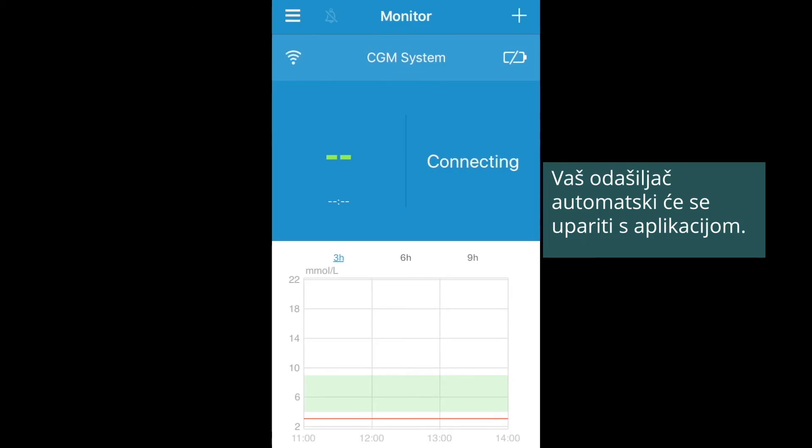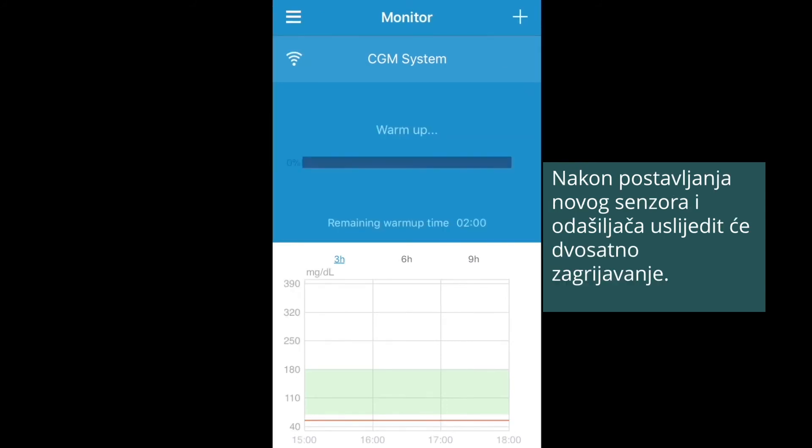Your transmitter will be automatically paired with the app. After applying the sensor and the transmitter, a two-hour warm-up will start.